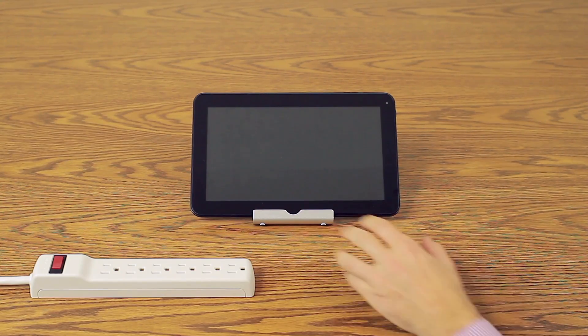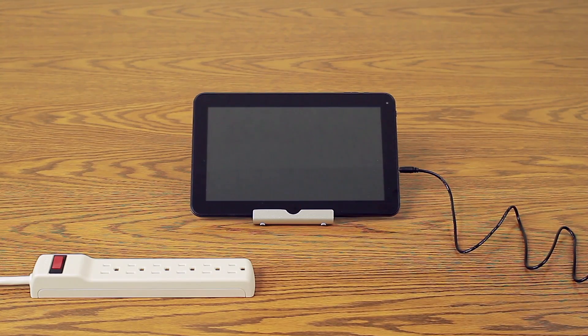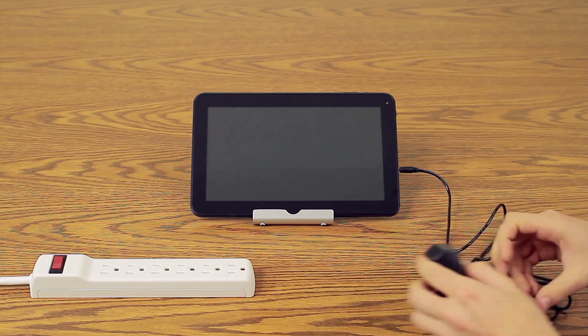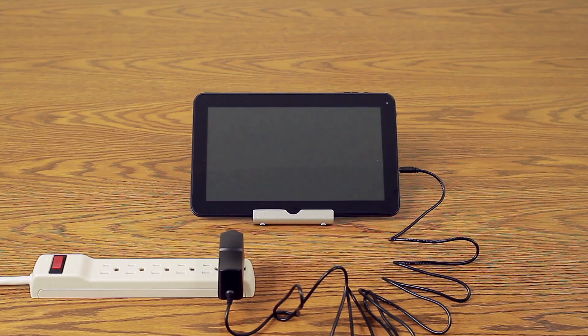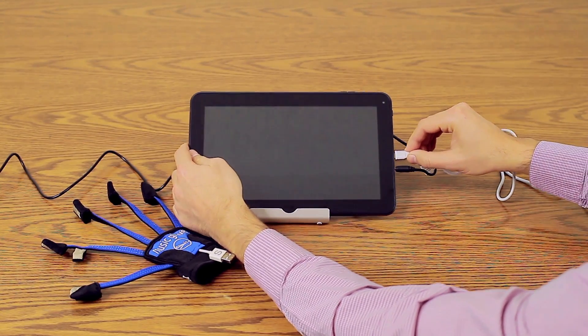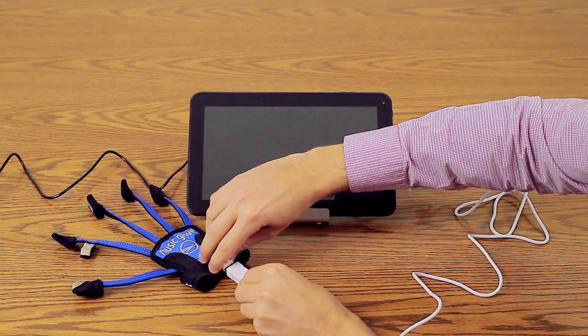Plug the power cord into the power port on the tablet and connect the other end into a power outlet. Once charged, the tablet can run unplugged for up to three hours. Plug the MusicGlove cable into the MusicGlove port on the side of the tablet, and plug the other end of the cable into the MusicGlove.